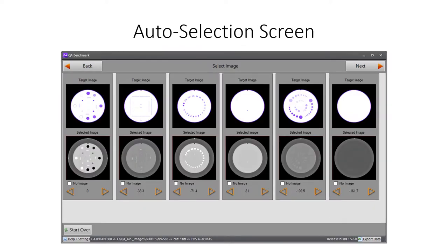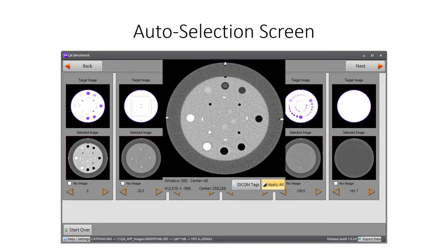The images selected for processing are displayed below a reference image for each module in the selected phantom module. This is the confirmation screen for the automatically selected images for our CatPhan 600. Users can override selected images with the arrow buttons below each thumbnail image. The user can also disable the processing of any phantom module. To adjust the window level for these images, the user hovers the cursor over the thumbnail image. The image will enlarge and enable window level adjustments with cursor movements. Changes can be applied to all images with the options provided.